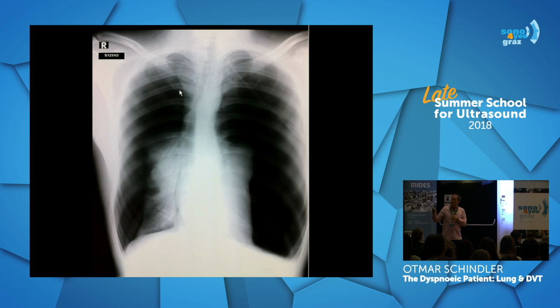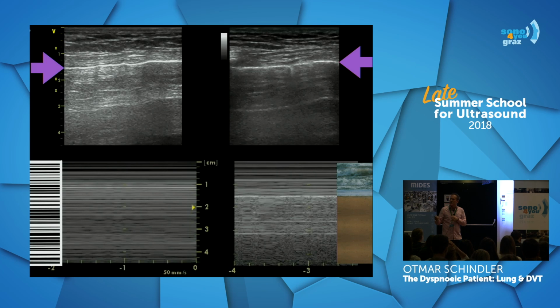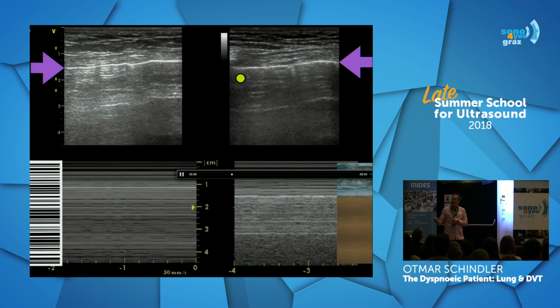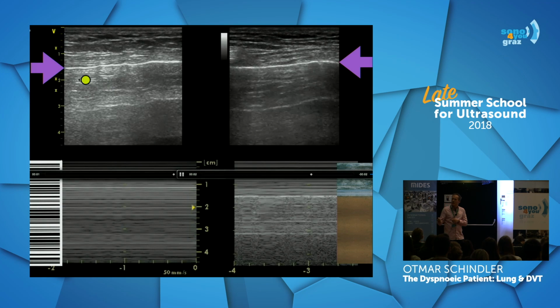And what's also a problem with that patient, and much easier with that patient, if you are suspicious of a pneumothorax, just compare it to the other side. Seeing pneumothorax takes a bit of experience. So if you see this patient and you're not sure is there something moving or not, just put the probe on the other side and you see there is a clear difference. That's what lung sliding looks like. In this patient, there's no lung sliding.